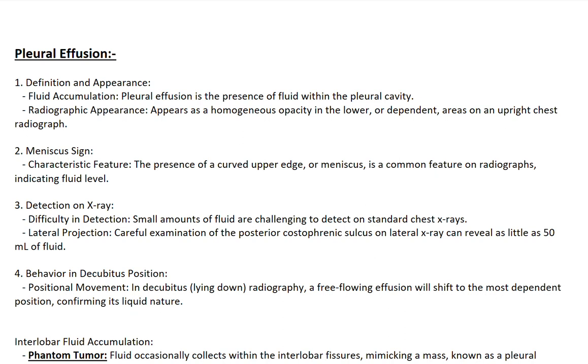nature. This concise breakdown encapsulates the key aspects of diagnosing and understanding pleural effusion through radiographic imaging, highlighting how positional changes and specific radiographic signs assist in detection and confirmation.